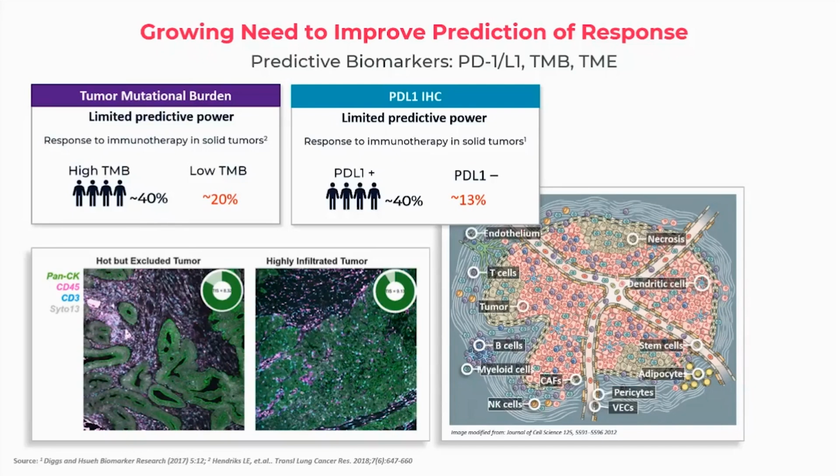Why spatial is important: if we look at these two tissues on the bottom left, and we were to mash them up and look at a bulk expression score, called the TIS score in this instance, tumor infiltrating score, they would have very similar TIS scores. But the tumor on the right is highly infiltrated compared to the one on the left. You can see that you've just got more pink cells within the tumor mass in the green. So getting that visual imaging data and understanding where that is in space and in the tissue is important to predicting response to therapies in this instance. A bulk measurement doesn't give you that.